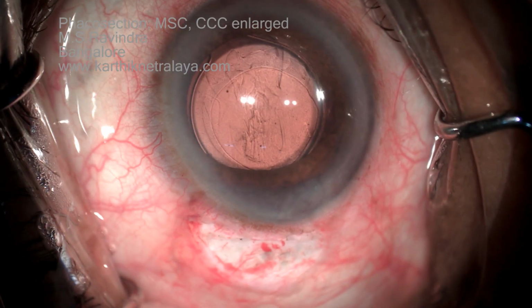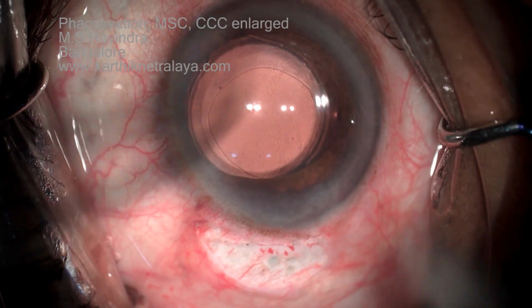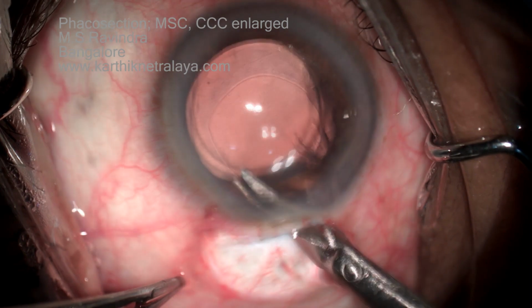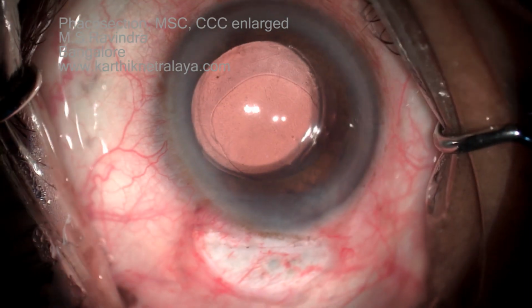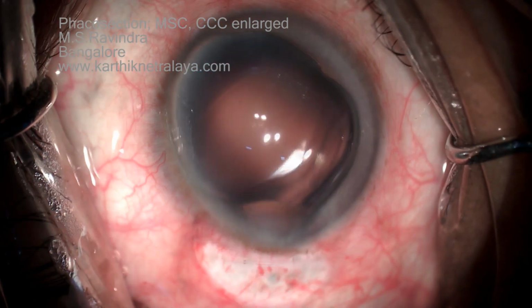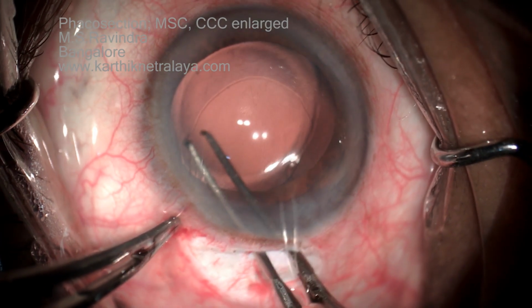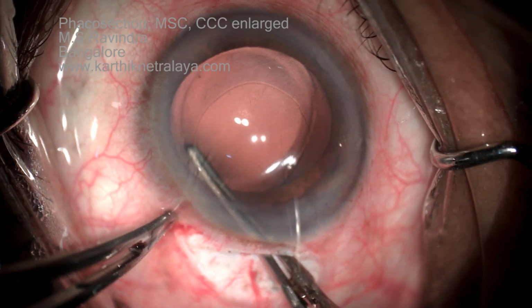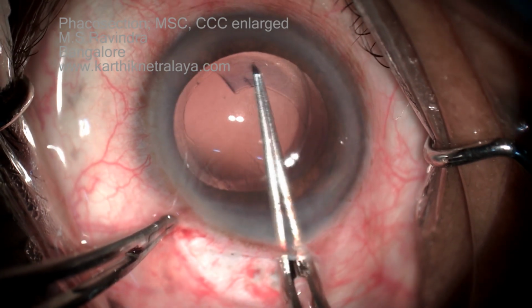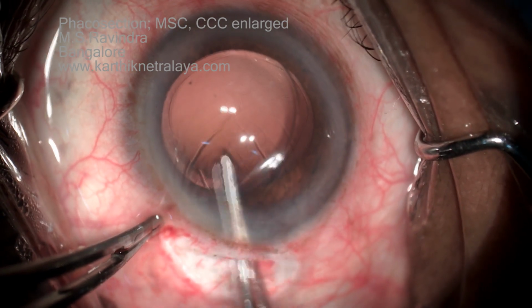This is a small rexis and obviously it will end up in phimosis a couple of years later. So I would like to enlarge it. A small nick is made on one side of the rexis with a Vannas. There is enough space in the tunnel to pass a standard small sized Vannas with a rexis forceps. So we could comfortably make a larger rexis so that it becomes circular, and the chance for phimosis is almost eliminated.